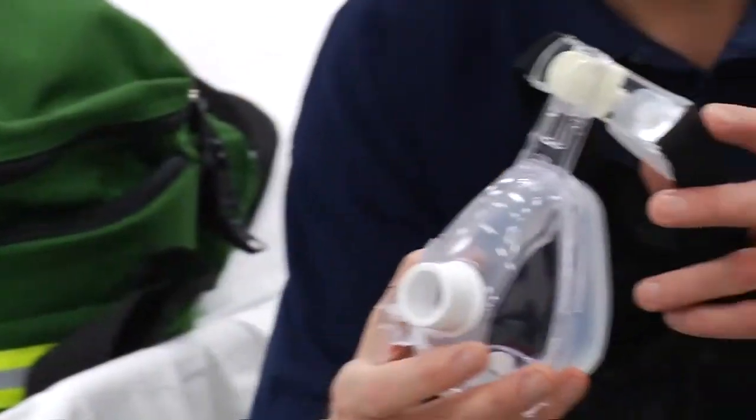The first thing I want to talk about with CPAP is the selection of the mask. Most CPAP units, disposable CPAP units, come with a single-sized adult mask. Everybody's face is different. You need to carry additional size masks, and oftentimes a smaller mask than the device actually comes with. There are 3 points that you want to look at when you're considering application of the mask to the patient. The first point is the lower part of the face where the chin clefts just below the lip. That's where the mask should initially sit on the patient.